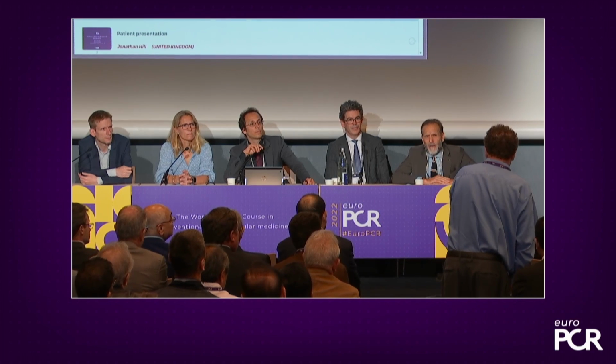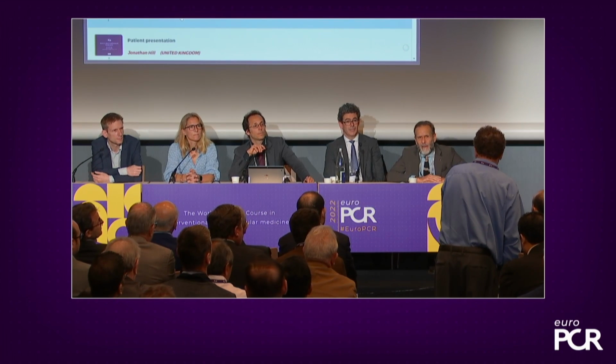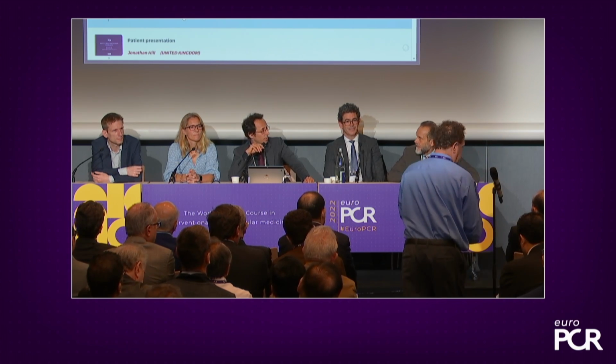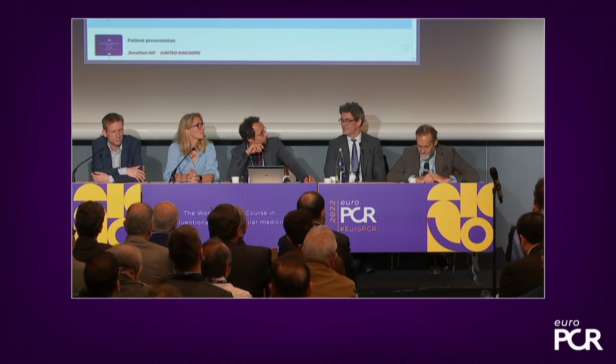I just think the one interesting point here is you have a bifurcation lesion right at that left main. The opportunity here for Shockwave seems to be the easiest, because you can protect your side branch. So why put anything at risk and drill with another wire in the circ when you can just stick a balloon in it? Yeah, sure, absolutely reasonable. So we'll see what you did, Benjamin.